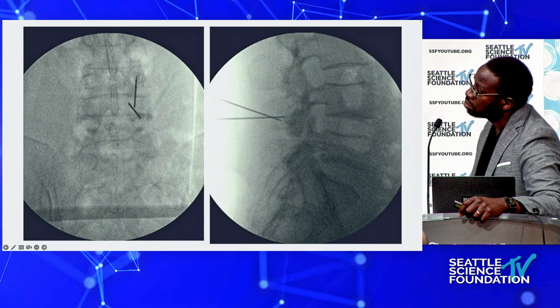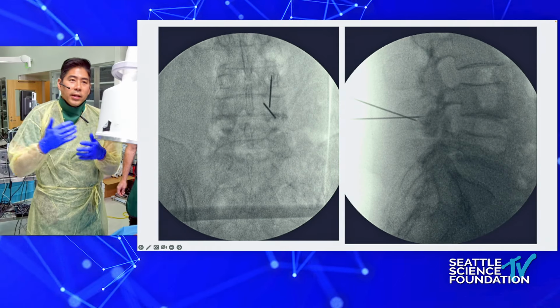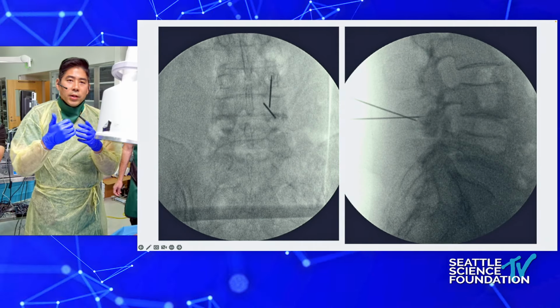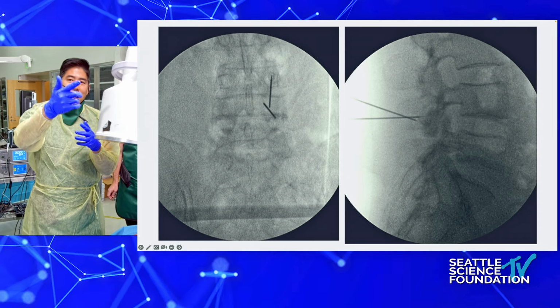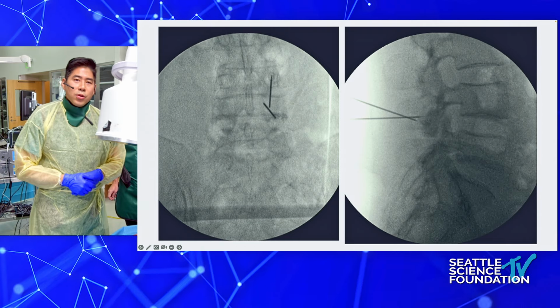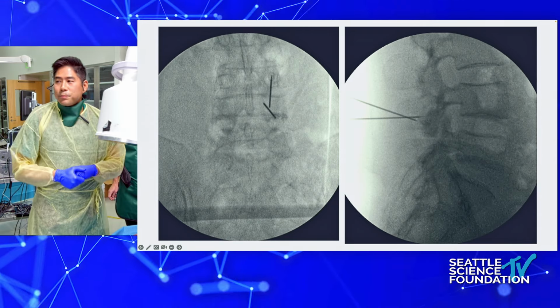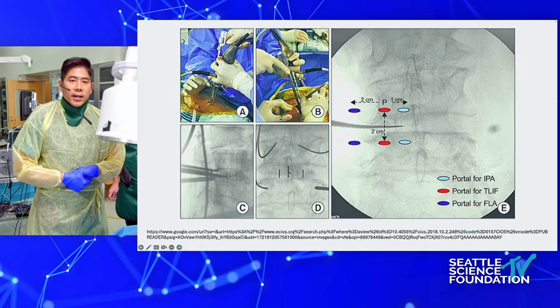Yeah, so that's sort of the typical. You want those two needles to be close to converged. And that picture is a little bit crisscross, but that's okay. You want the two needles to be converged at this level. So you can go to the next slide.